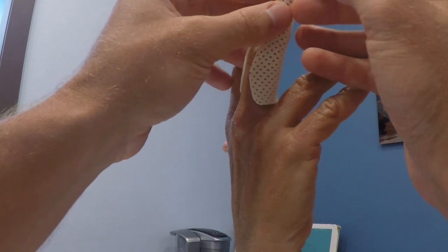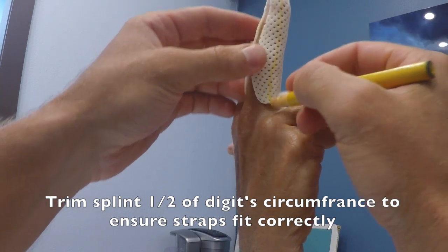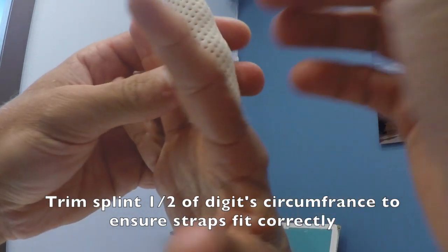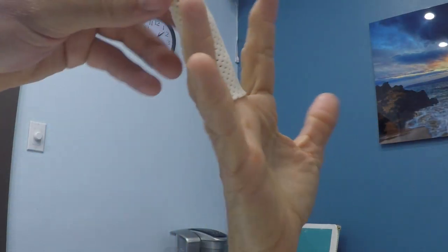We're going to draw a line going straight down and cut it — right down the lateral aspect of the splint on either side. Then take it off.